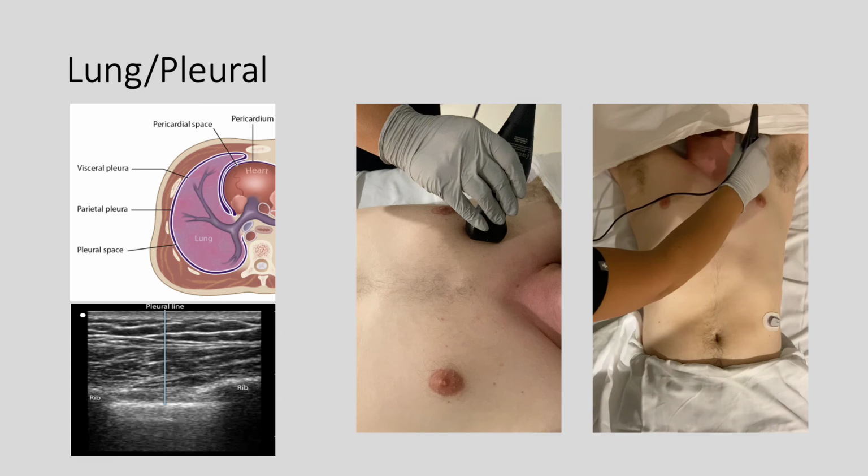The lung ultrasound exam is started along the anterior chest in the second or third intercostal space and descends caudally in a systemic fashion as needed. This initial starting position enables evaluation of the upper lung fields, which is the least gravitationally dependent area of the inner hemithorax. Moving the probe inferiorly will enable scanning of the lower anterior lung down to the diaphragm.